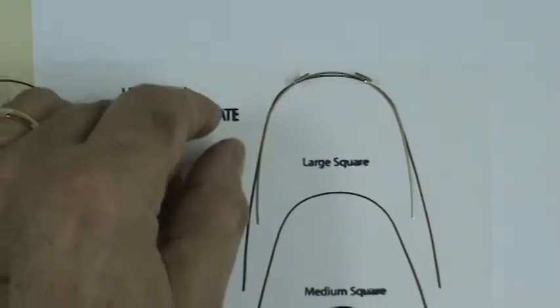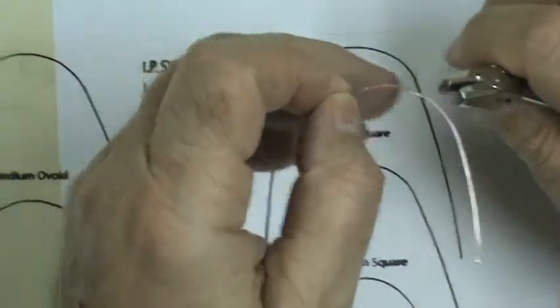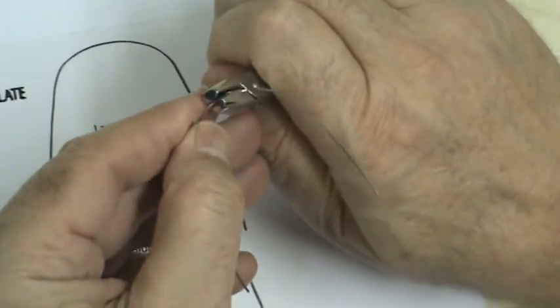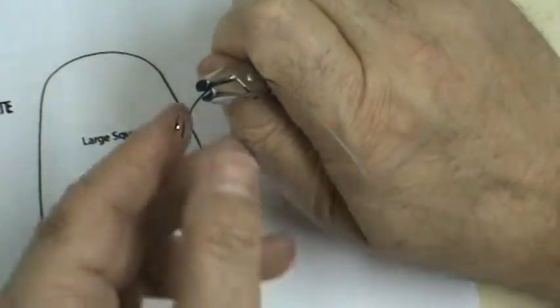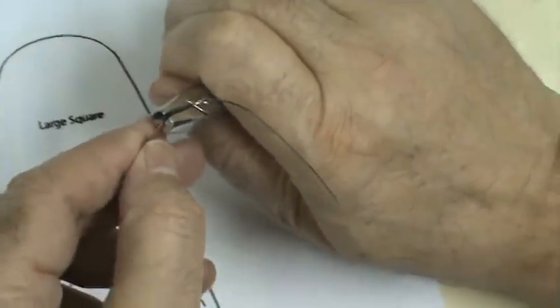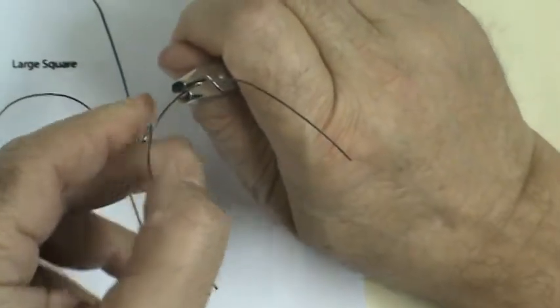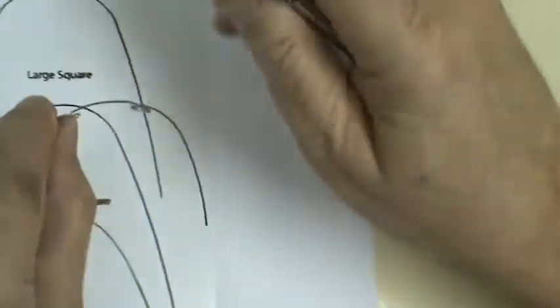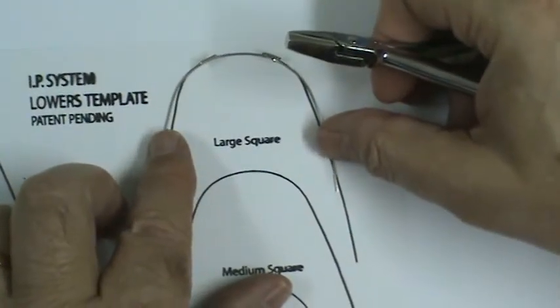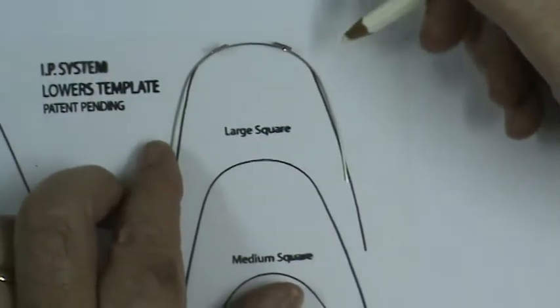So to do that, I'll take a hollow chop plier and I'll start at the midline and I'll give it a little squeeze, and I may slide it over here, give it a little squeeze, slide it over here, give it a little squeeze, and let's see how close we came. That looks pretty good.